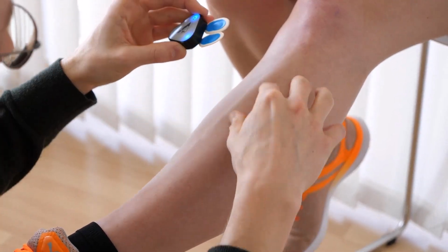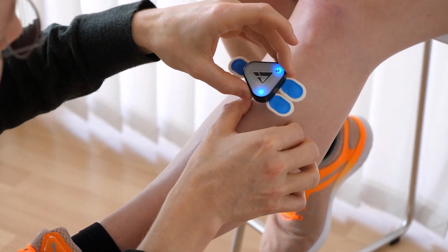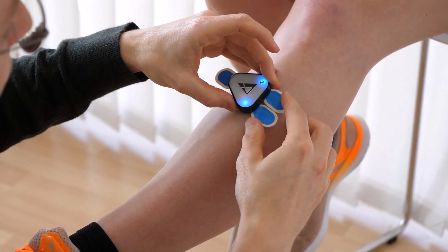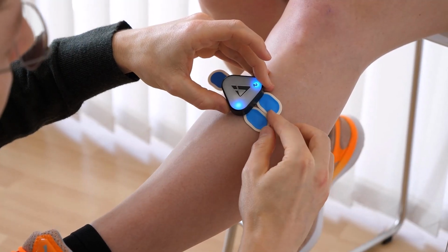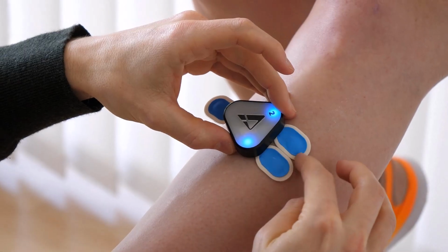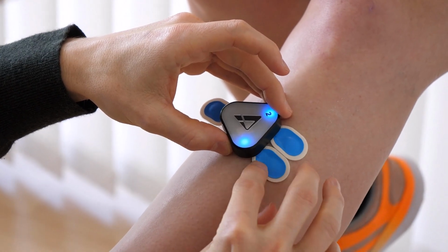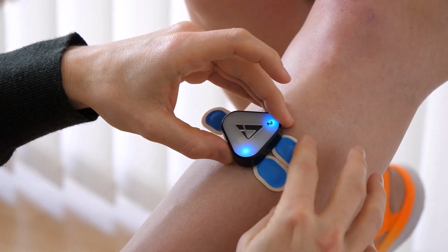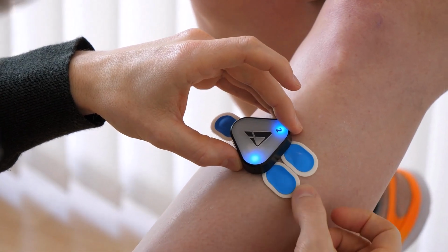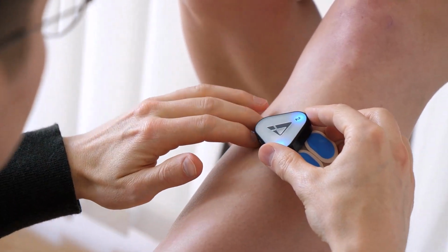Then we make sure again that the position fits with respect to the tibia and attach the electrodes. It is especially important that I press the electrodes on the edge and only then give a slight pressure in the middle. I will show you why in a moment. I do the same with the reference electrode.